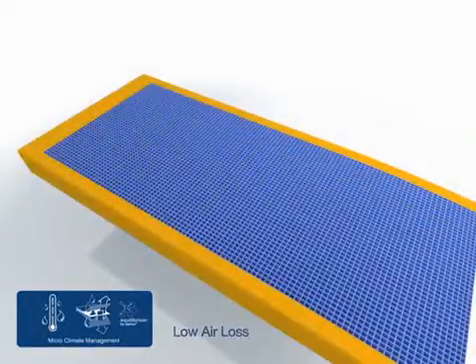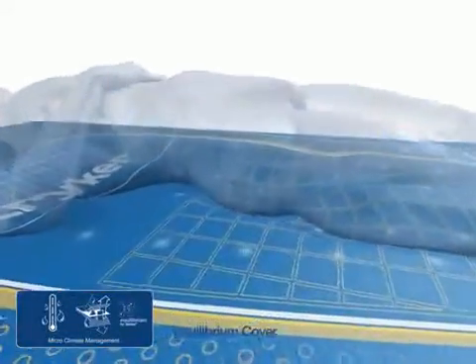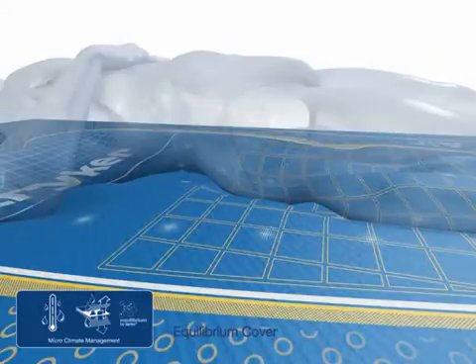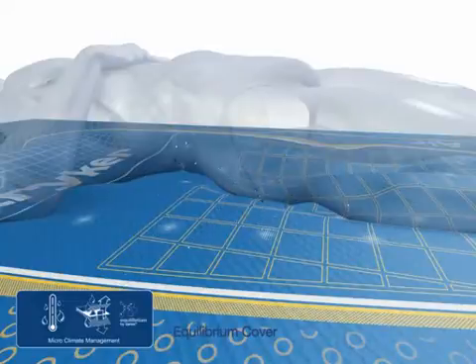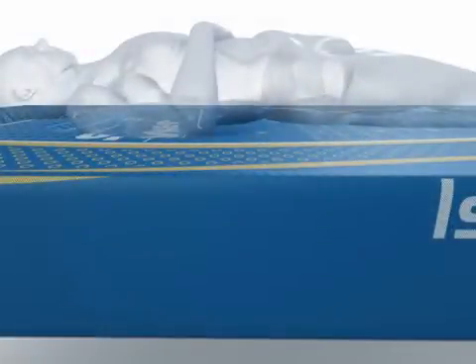The exclusive equilibrium cover by Dartex equalizes pressure redistribution while balancing the microclimate of the skin through its highly breathable yet durable fabric. The equilibrium cover wicks away moisture from the patient while the low air loss system balances the microclimate of the support surface. The combination of the cover and open gel column design allows air to flow freely throughout the surface without obstruction.